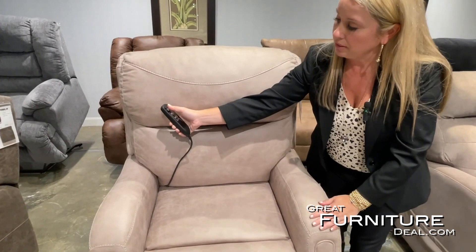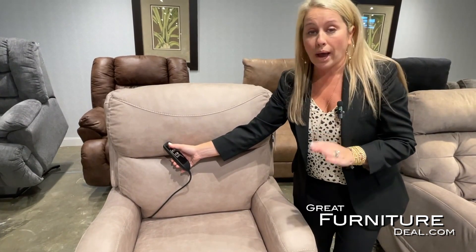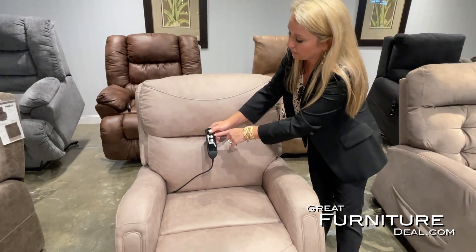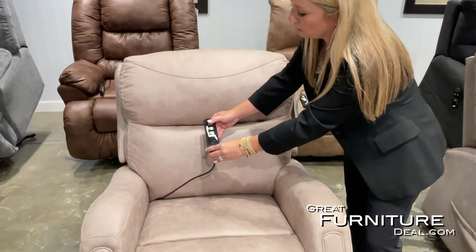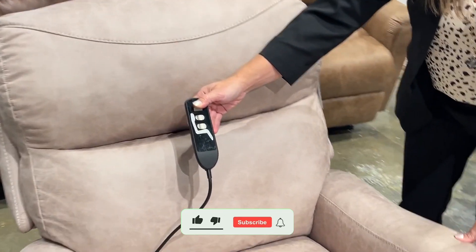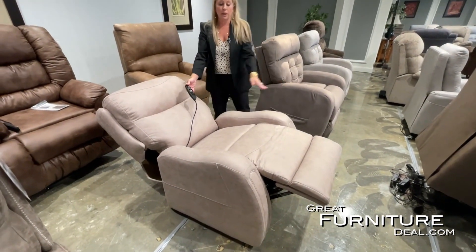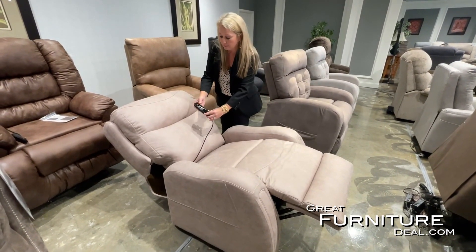We're going to bring that chair down, and you can hear nothing — this is a silent lift mechanism; it's quiet and very smooth. Now we're going to recline back. The other two buttons on this remote are for other features we'll show you once we get to the full recline position. This is going to slowly open up and you'll see that full chaise pad from the seat all the way to the feet.